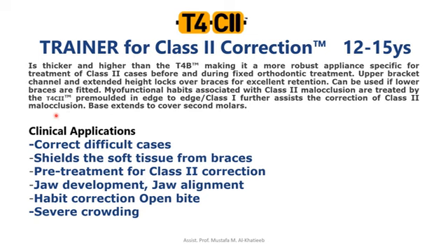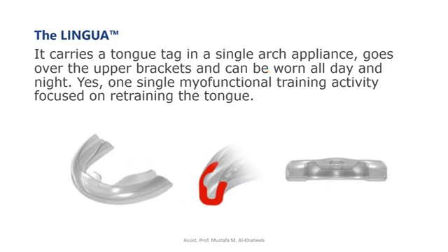Okay, similar to monoblock. The base extends to cover the second molars. Their clinical application: correct difficult cases, shields the soft tissue from the braces, pre-treatment for class 2 correction, jaw development, jaw alignment, habit correction, open bite.